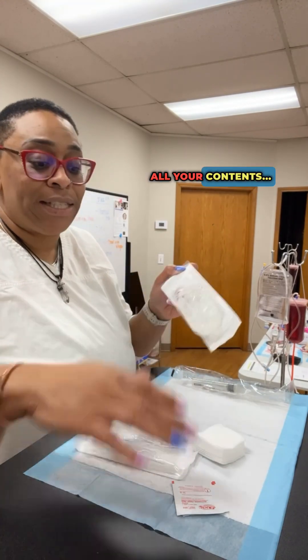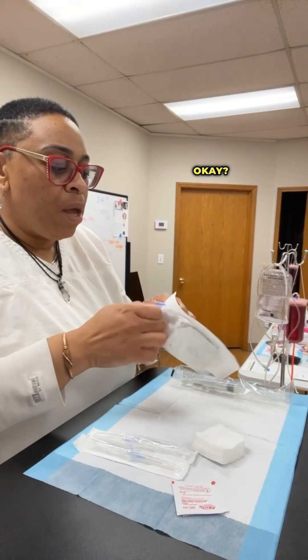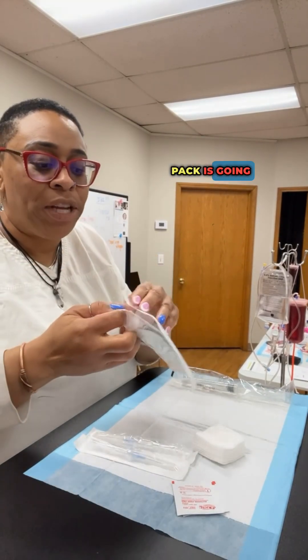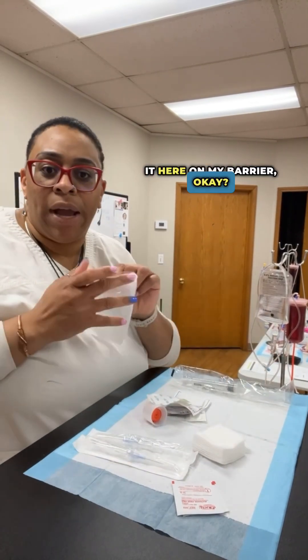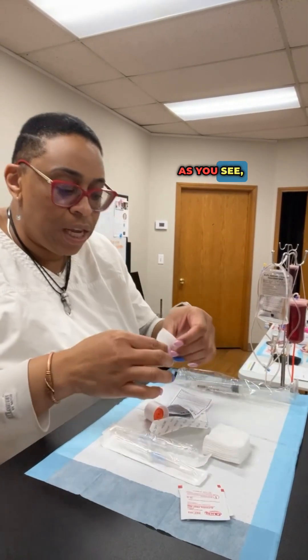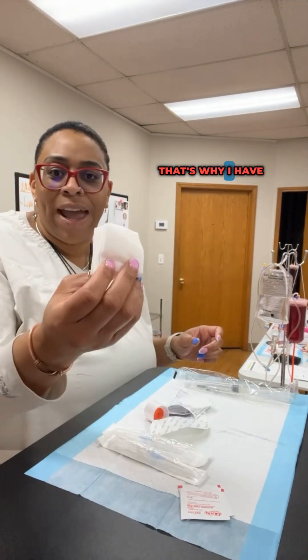Remember, have a barrier here. All of your contents inside of this IV start kit pack is going to be sterile until you open it, and I'm dumping it here on my barrier. It's always good to have a barrier and have all of your supplies here. As you see, the IV start kit only comes with two two-by-twos — that's why I have extra.